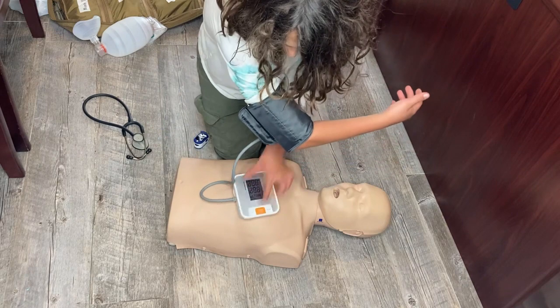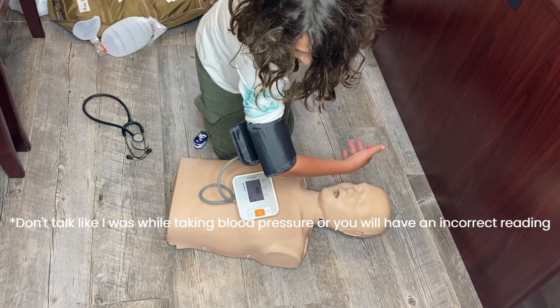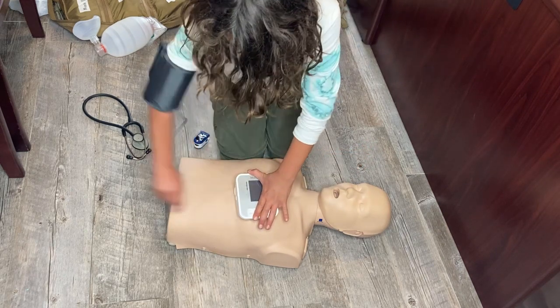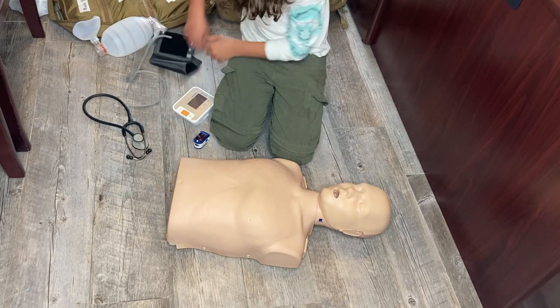Starting, all right. And then here it'll go. And you can hear it, it's going to get my blood pressure. And it's going to get very tight. And that is how you do blood pressure. Let's take this off now.